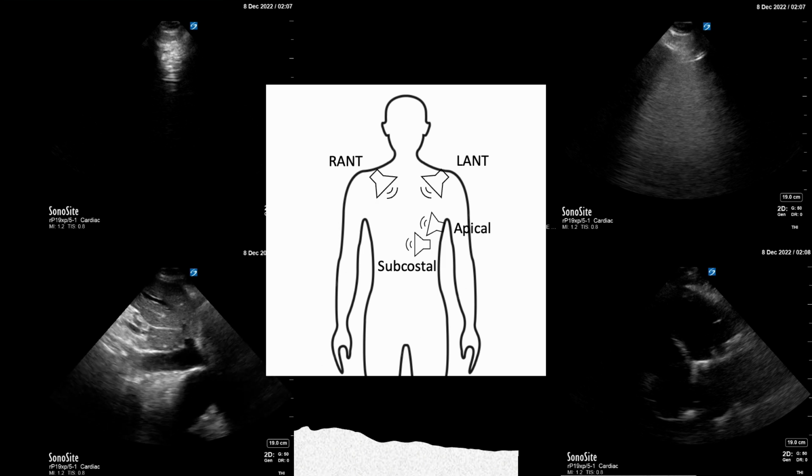With the inferior vena cava, you can get a bit of pulsation in it, but it just looks different, and you'll find what's called the middle hepatic vein that runs off it, which you can see in the upper aspect of the image that I'm showing you now. And you can see it's quite big. I'm asking the patient to sniff while I'm looking at it, and it's not really collapsing, so it's dilated, it's not collapsing more than 50%. For me, this is enough evidence to say it's fluid overloaded.